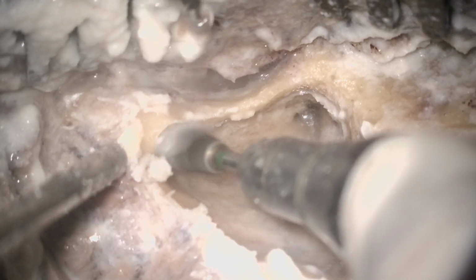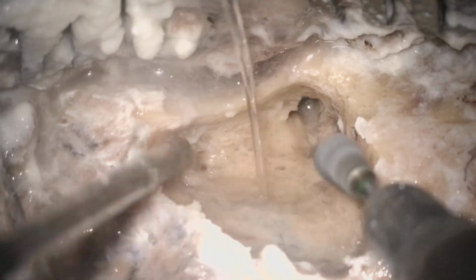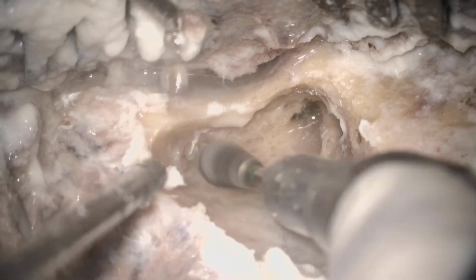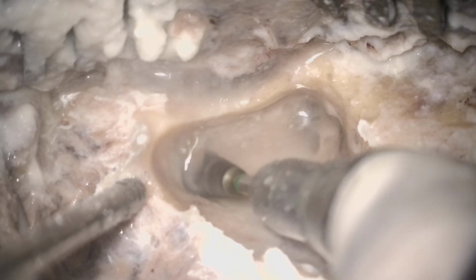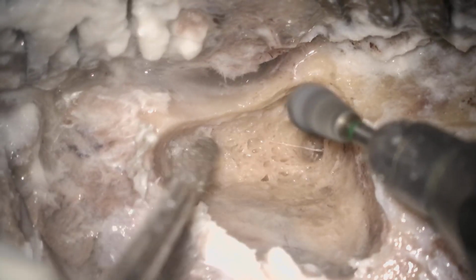In the majority of cases of COM, the actual block is in the anterior part, in the opening of the eustachian tube, in the epitympanic space where the ventilation pathway comes from the eustachian tube to the aditus and the mastoid antrum. In that region you have some block, some hypertrophy, some granulation, the effect of COM that leads to the complete ventilation block of the mastoid antrum, and in those cases the drilling is required.